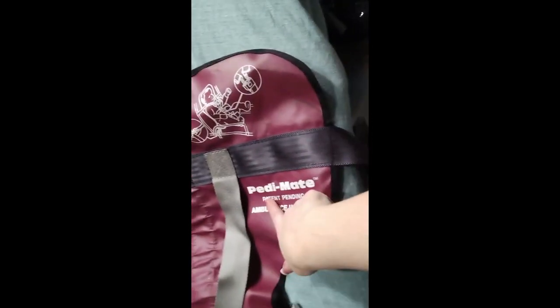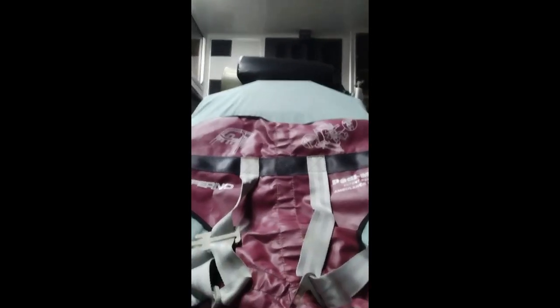Hey everybody, several people have asked me to do a video on how to use the PD mate. This thing right here says PD mate — there's one under the bench seat. This is for when you have a baby that is too little for the car seat in the captain's chair. It can look kind of intimidating, but it's actually not too hard, so I'm going to show you how to use it.